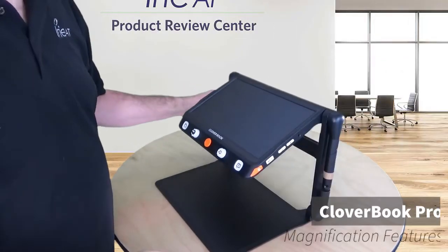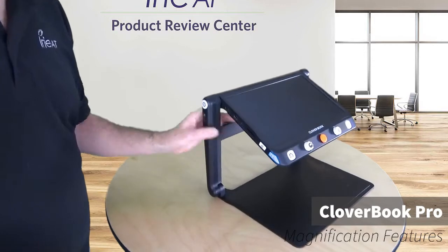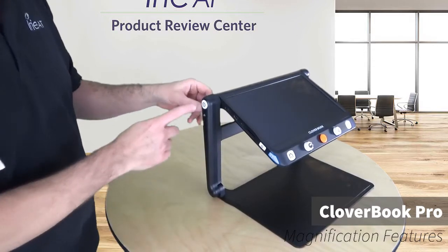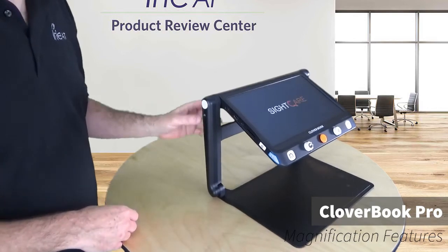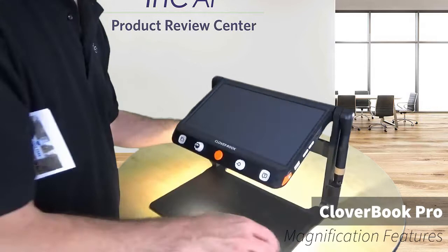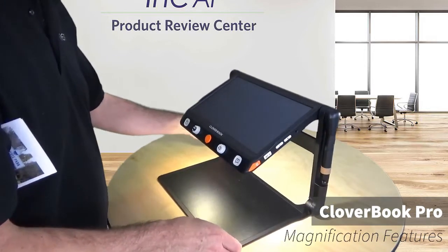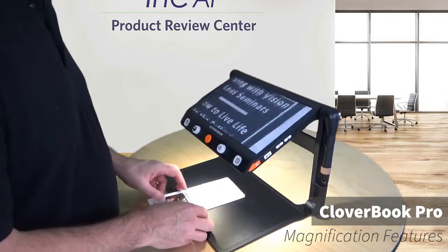To turn on CloverBook, there's a button on the left side, on the left arm at the top. You touch it and hold it for about 2 seconds. The green light comes on and the device fires up. So we immediately go into live magnification mode.